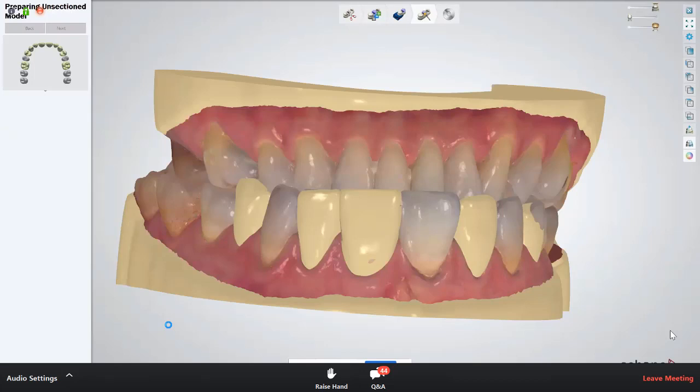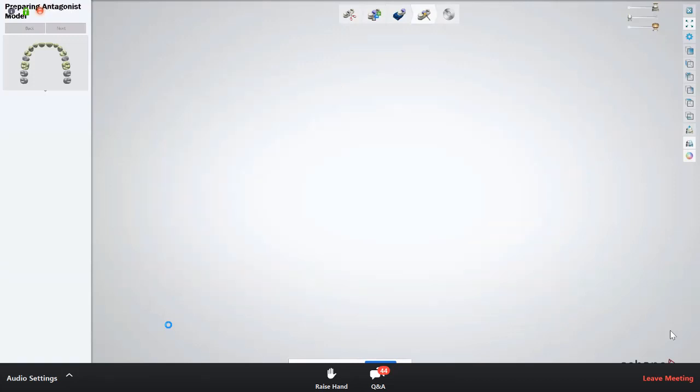The same goes for implants, for instance. If we do temporary dentures, etc., then we try to reuse the designs we already made once as much as we can. But definitely, it's something I could show in a future webinar, of course.